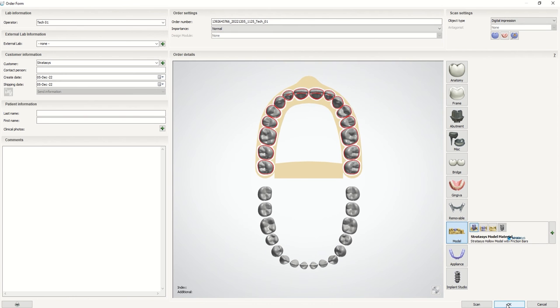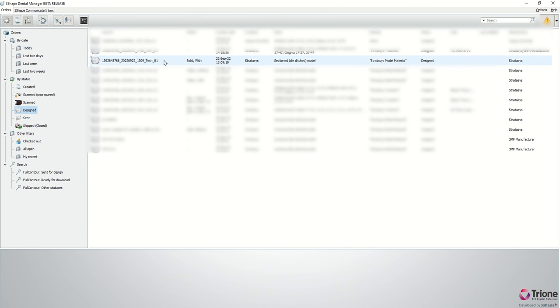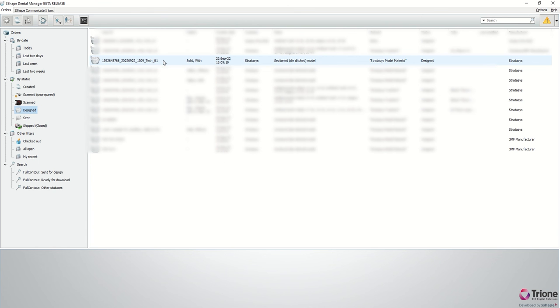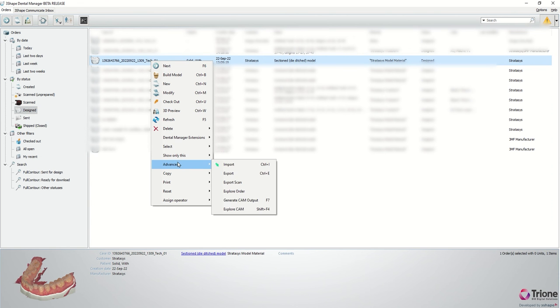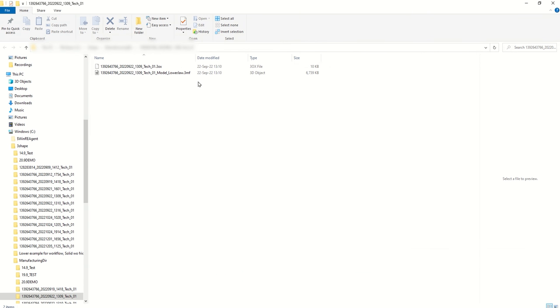Now continue with your regular workflow to create a dental model. When you're done and want to open the created 3MF file, go to the Orders tab and right click a Case ID. Under Advanced select Explore CAM. This will open the folder containing the file you just created.